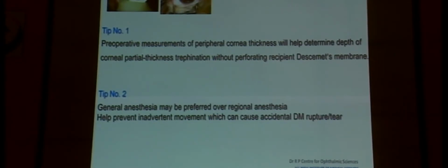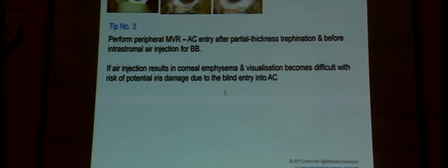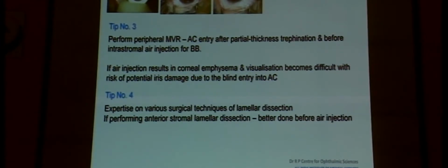Most surgeons seem to prefer general anesthesia, especially when they are beginning, but once we are experienced, we are quite comfortable doing our surgeries under regional anesthesia as well. But remember, you do not want inadvertent large movements that can cause a rupture of the Descemet's membrane. Always remember to make your side stab entry before you do your bubble, so your chamber is deflated a little and you have the space for the bubble to move in and push the Descemet's into the anterior chamber. So don't keep it too taut, otherwise this could be an impediment to your big bubble achievement as well.